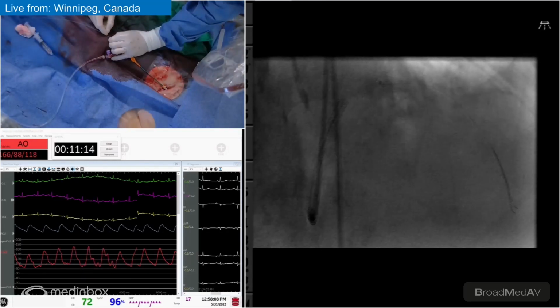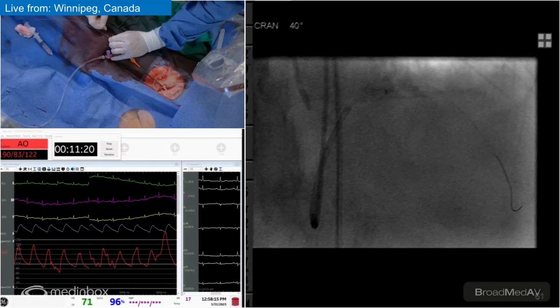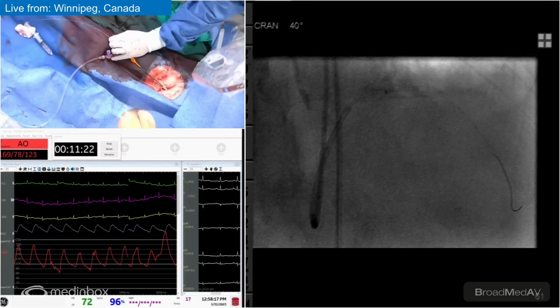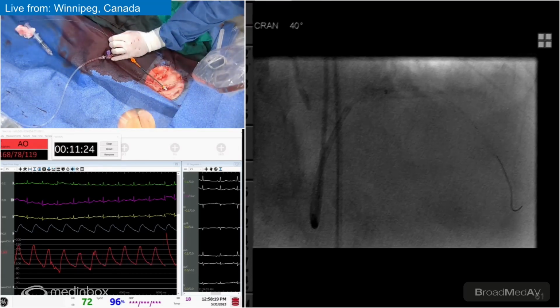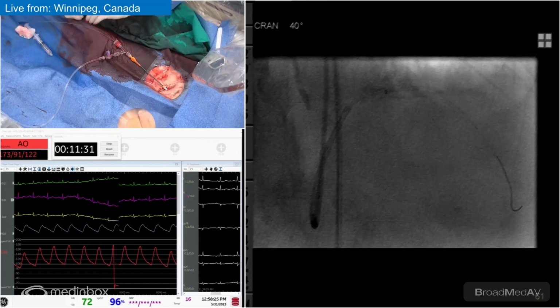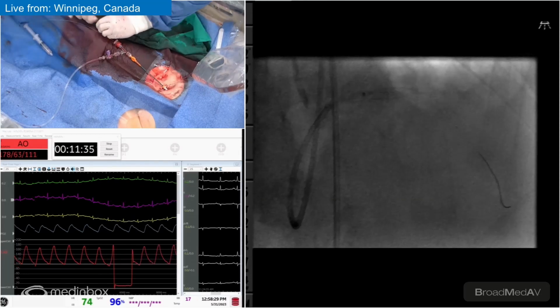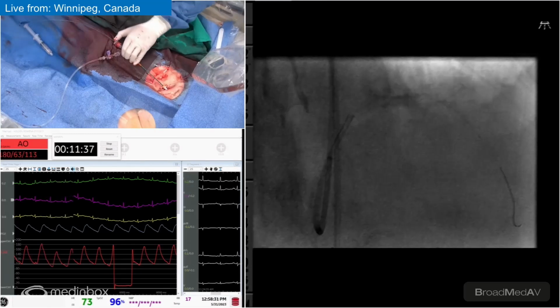Let's get a 2.0 softy balloon. I'm going to use a GBAT just to inflate the tip of the guideliner, see if I can get it any deeper. Oh no, the old one's good. Yeah, and we're running out of time, so let's do the angiogram at least, for the sake of what the plans are. Let me get the guideliner back. Get some air out. Yeah, very good.